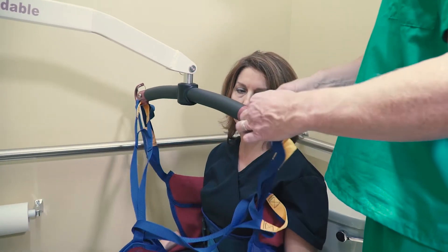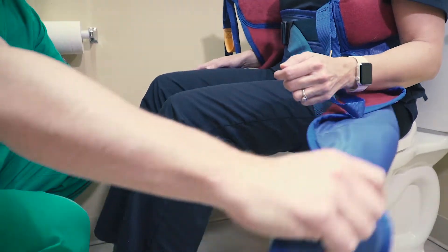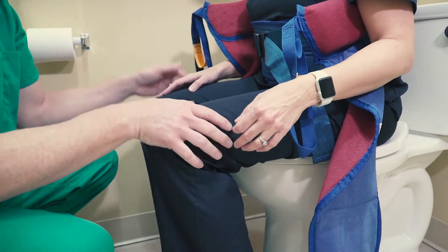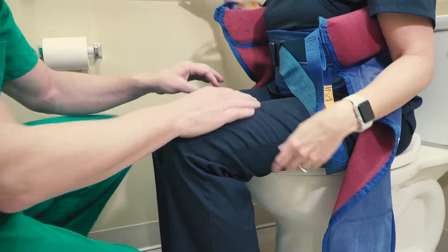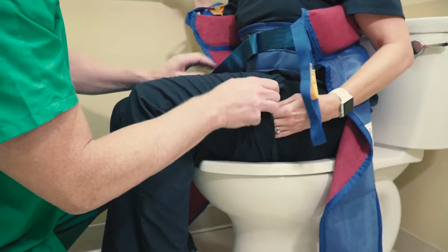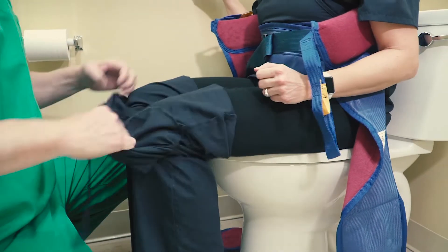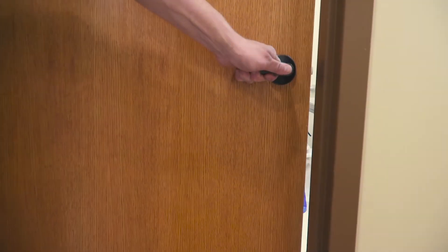Unhook the sling loops from the lift, unlock it, and move the lift out of the way. Some patients may want some additional freedom of movement, which you can provide by gently lifting each of the patient's legs to remove the leg straps. You can now assist the patient in pulling their pants all the way down to the ground before exiting the bathroom.